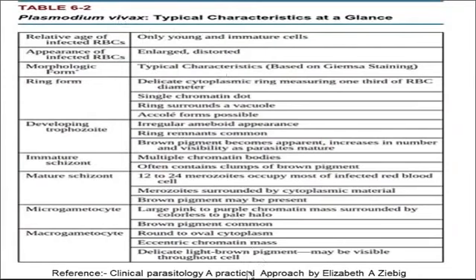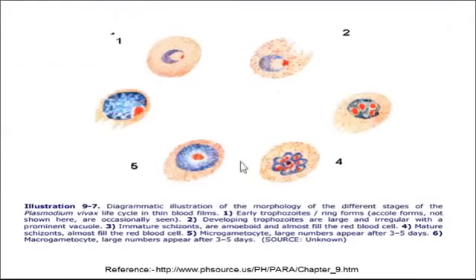Now, I got this table from Clinical Parasitology, a Practical Approach by Elizabeth A. Zeibig. This shows the various stages at a glance, and you can really read it out yourselves. And this also is a picture that I got from the internet. The source I have provided below.